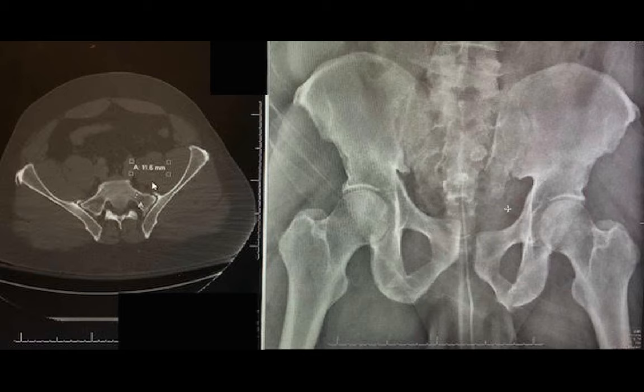So the other option you could do, and I did consider this, is perhaps fixing the ramus fracture through some kind of anterior column fixation with a screw, then fixing the symphysis and hoping that all of this together will help pull the SI joint together. The other option is to just address the SI joint from the back and hope that closing down that SI joint from the back will help improve the position of the symphysis.